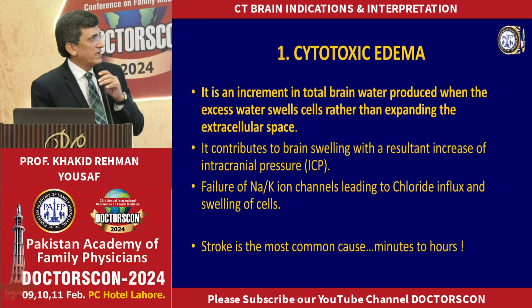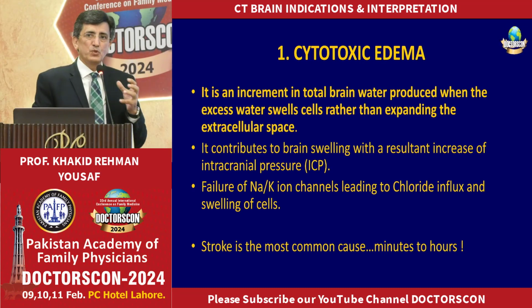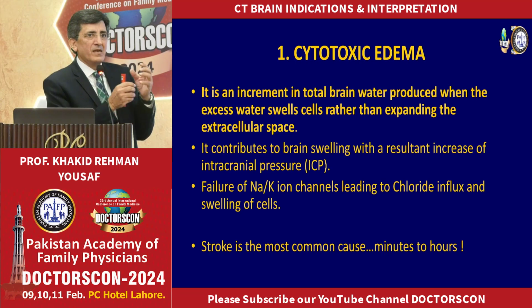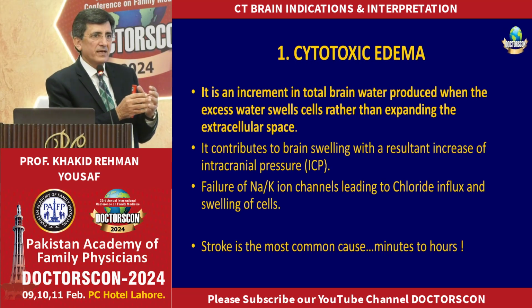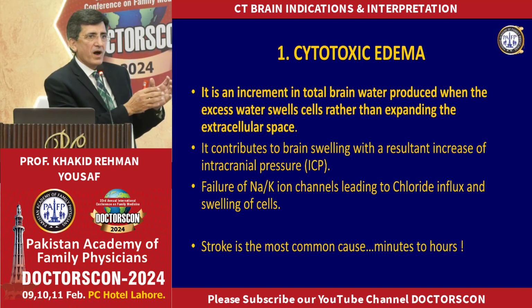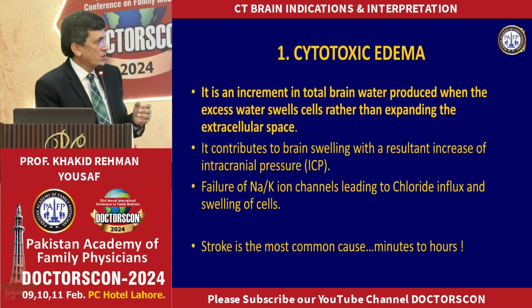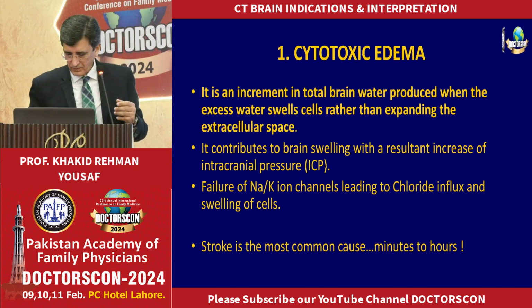There is an influx of chloride, and this leads to retention of fluid. What we see on a CT scan as ischemia or infarct, this is the reason we see that swelling of the cell, which appears hypodense. Stroke, this cytotoxic edema comes in minutes or hours.